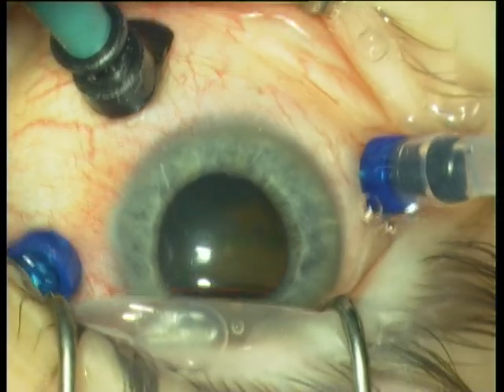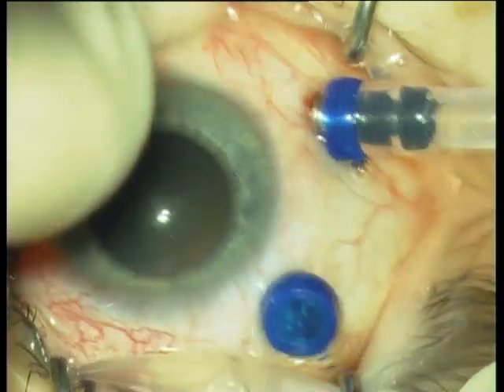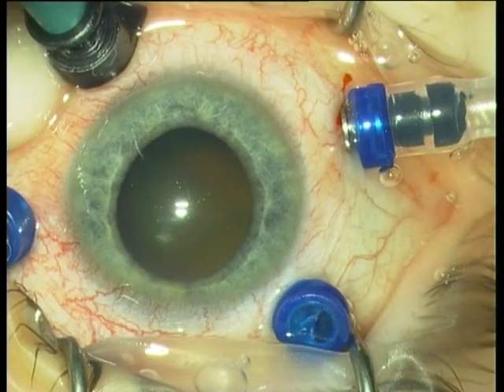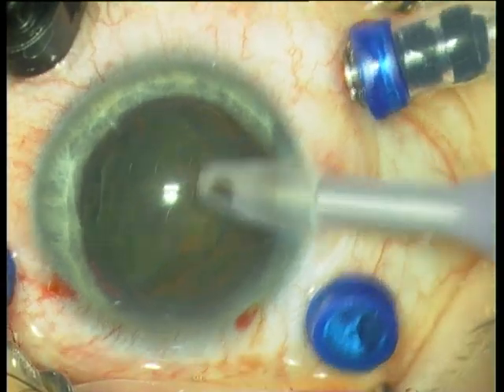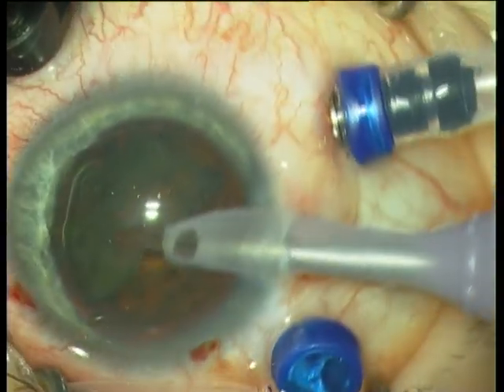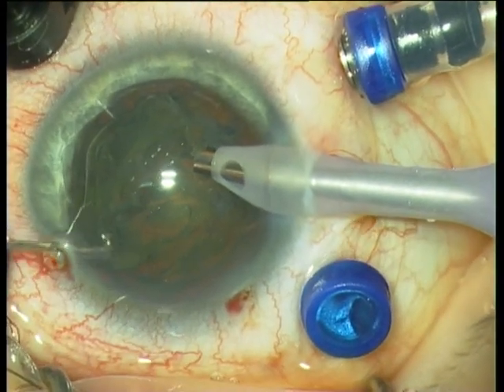This video demonstrates the management of a really difficult diabetic case. This male patient is 42 years old, has badly controlled type 2 diabetes since 15 years and poor compliance. His eyes were never laser treated. I perform a phaco because of the severe work which has to be done in the posterior segment.